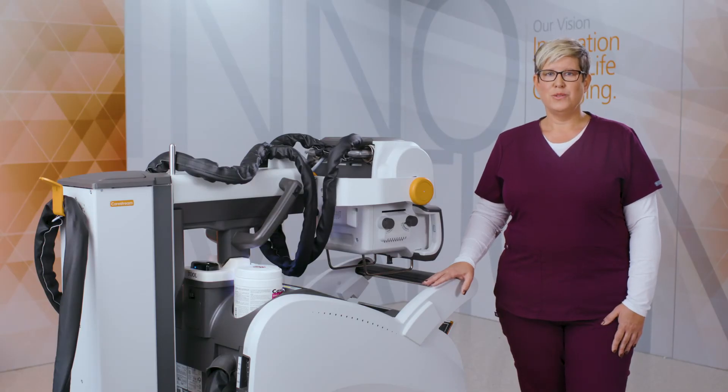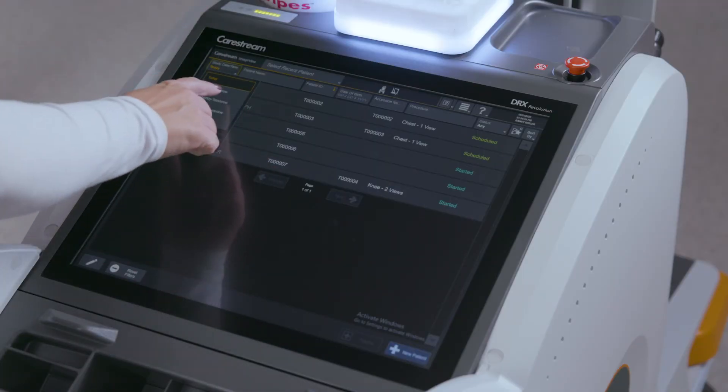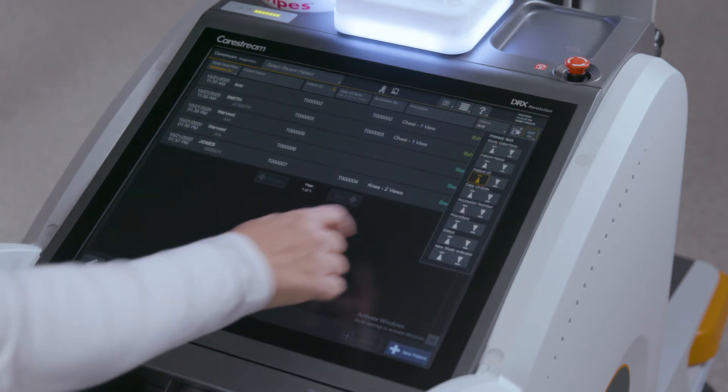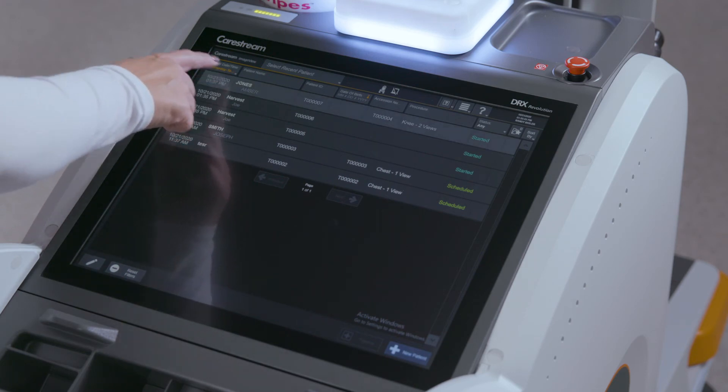Revolution uses ImageView software, the same platform as all other CareStream systems. This common user interface significantly reduces training time and allows the facility consistency among users. Patients and exams can be added manually or selected from those populated through a HIS-RIS system. Patient information fields can be sorted by clicking on them, and clicking on the patient will start the exam.